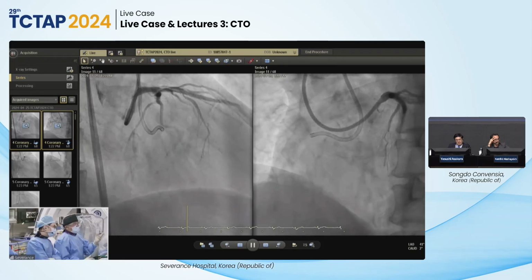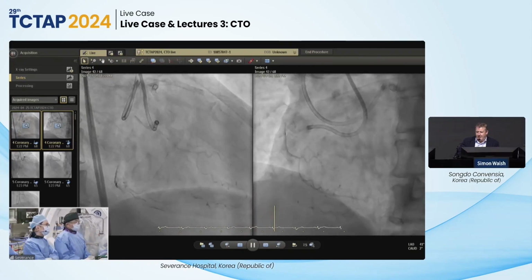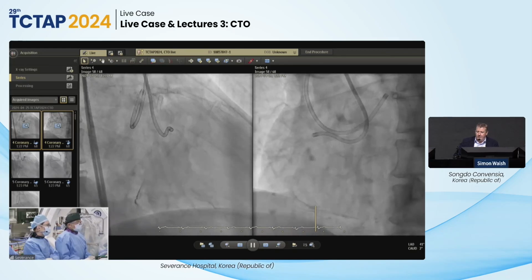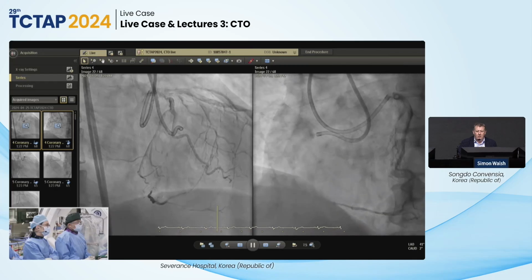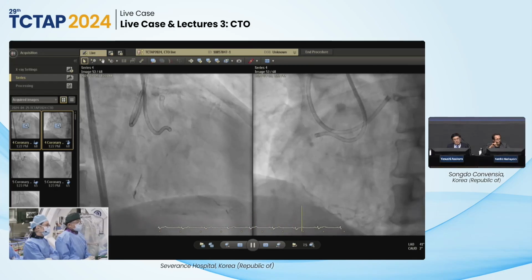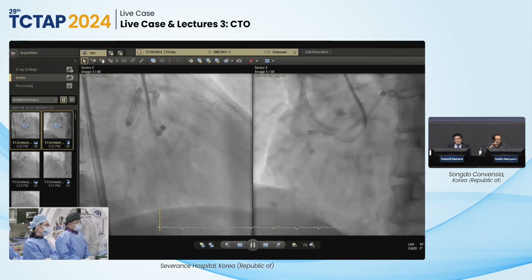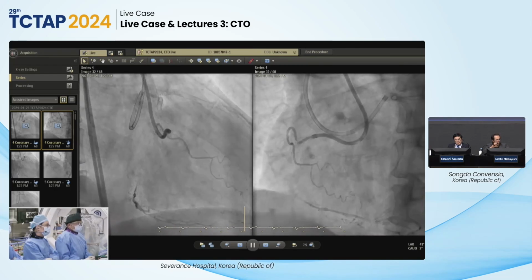The proximal LAD stent, yeah. I think you're seeing the circumflex stent en face and the LAD stent behind it in the right-hand panel there. Maybe there's a lot of plaque burden there as well, right? Because it looks a little bit dog-boned there. Anyway, maybe plaque modification was not so easy at that point with eccentric plaque.